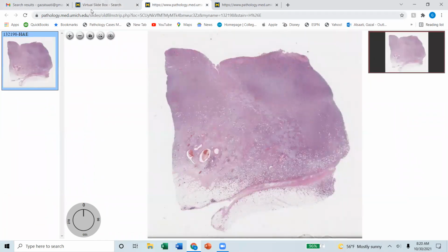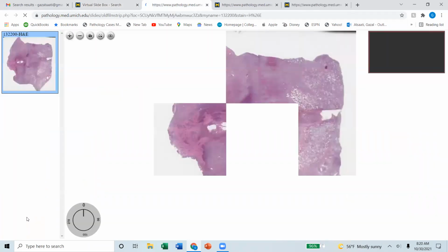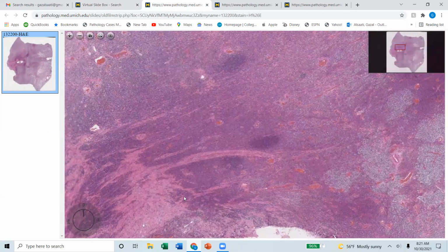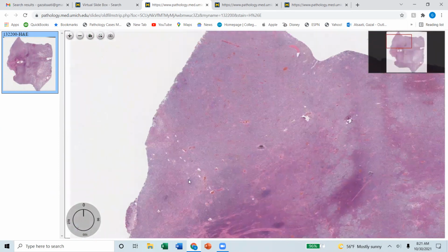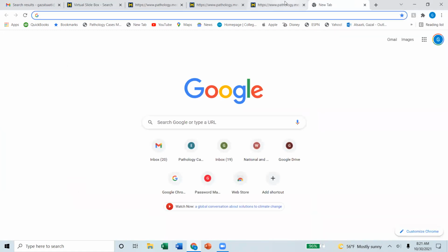No. Another. Again, let's look at the last one. Hopefully we're gonna get an H&E. Okay, they're all tumor-based biopsies. Is there a little bit of epithelium on the top over there? Go, no, over there. No, not there. Down, down, down, not there. Down. Oh, what happened?